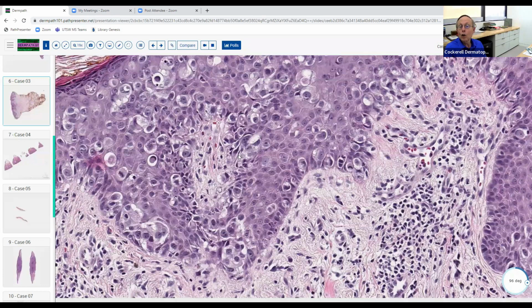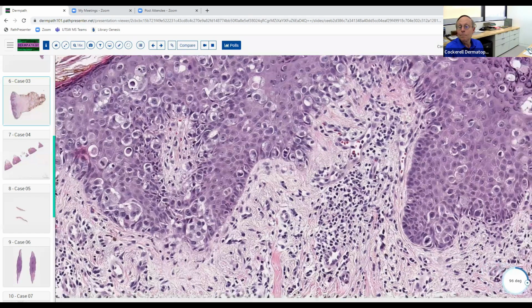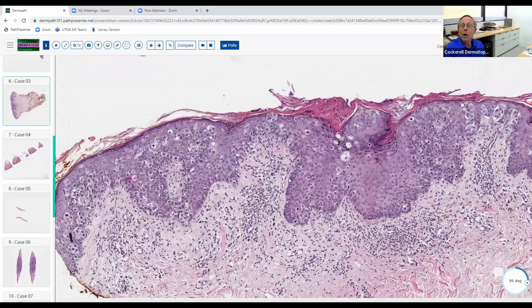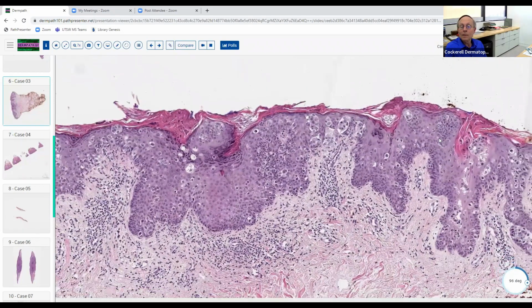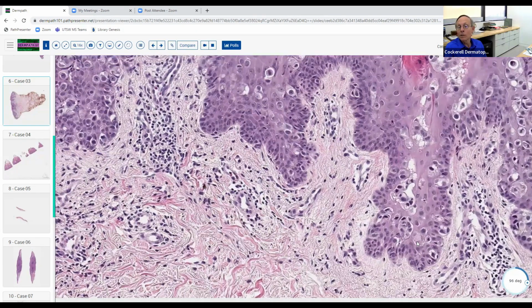So that's a clue that you're dealing with one of the, like Bowen's disease, pagetoid Bowen's, which usually is a full thickness keratinocytic atypia throughout. Here you've got normal keratinocytes interspersed with the cells here, which are actually basically metastasizing into the epidermis. So that's actually how this process is really ongoing here. And this was from the breast in this case. So this was Paget's disease of the breast.